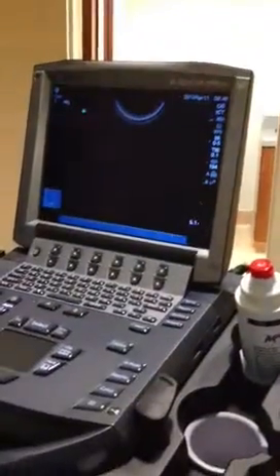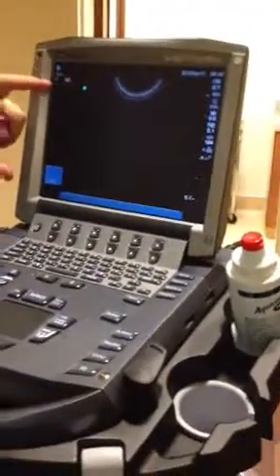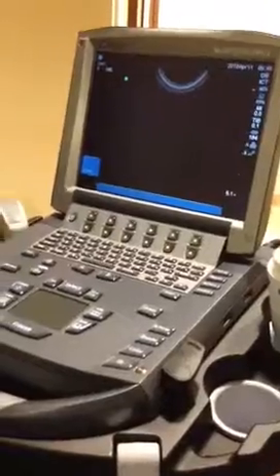The panel itself, the purple tops are fine for that. The screen, just use a damp paper towel followed with a dry paper towel. No solvent on the screen whatsoever. It is 3-foot drop tested. The probes are 3-foot drop tested, as long as there's no obvious sign of damage, like someone came in and cut the cord, or that you have eroded the rubber.